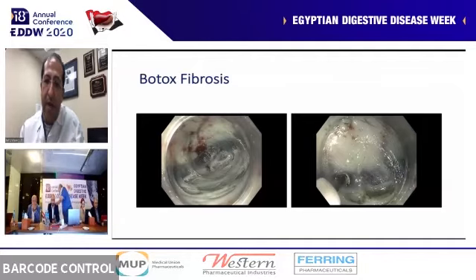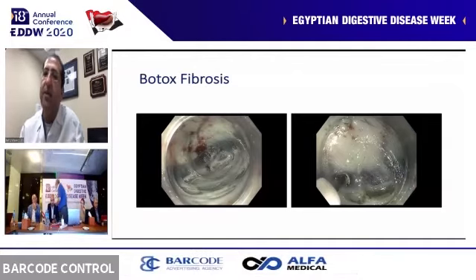The submucosa is completely adherent to the muscle, adherent to the mucosa, and there's traction. You can see that in the picture to the right, not as expandable of a third space.